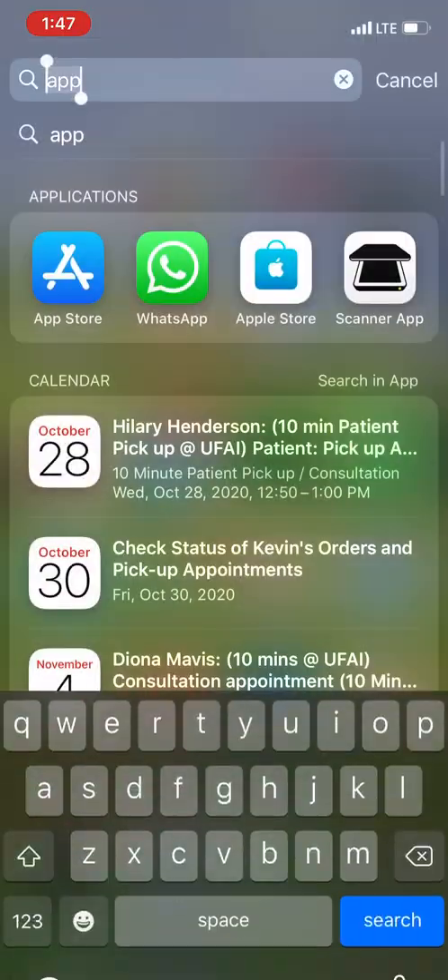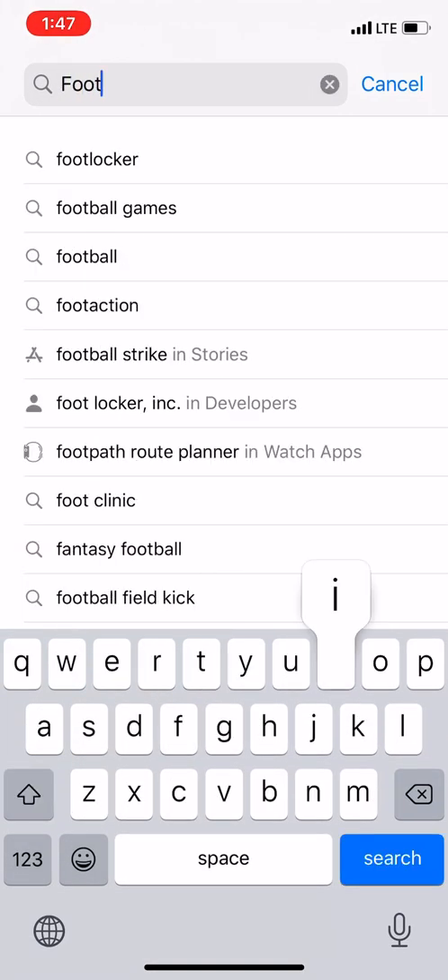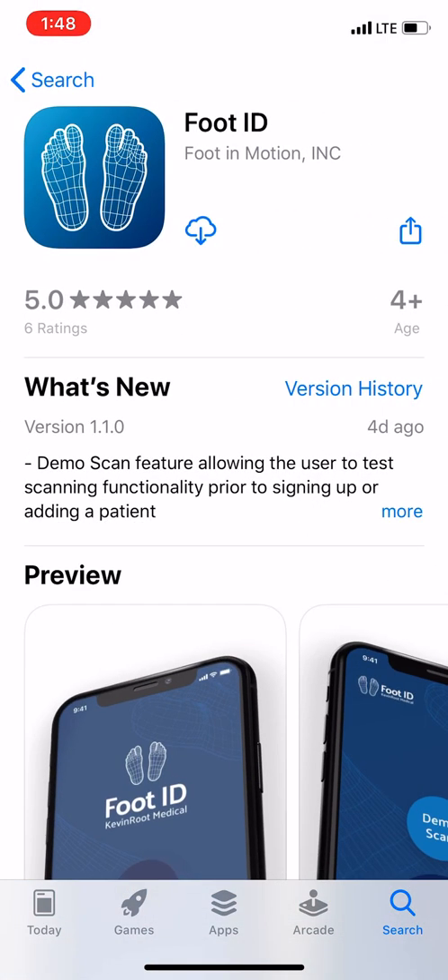We're going to go to the App Store and download FootID. Search for FootID up in the bar here and it should come up right here. Let's go ahead and download it. Depending on your internet speed, it could take a little bit of time. This seems to be cruising along pretty fast, so that's good.